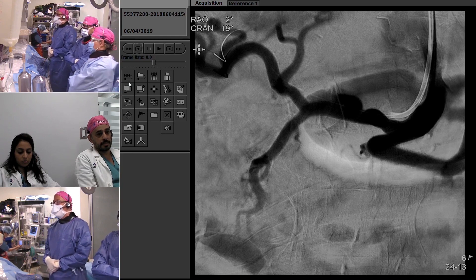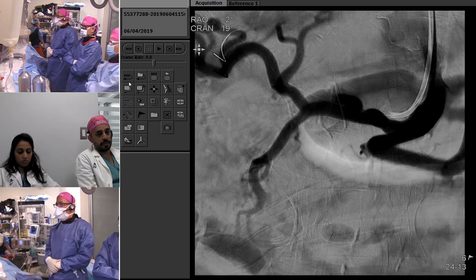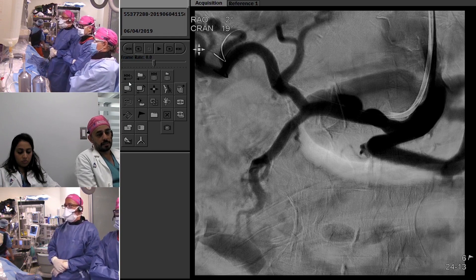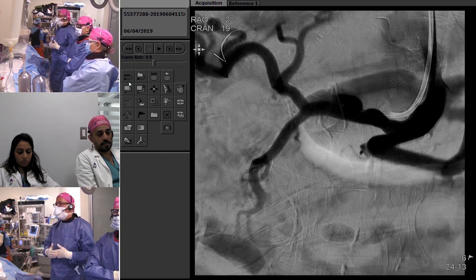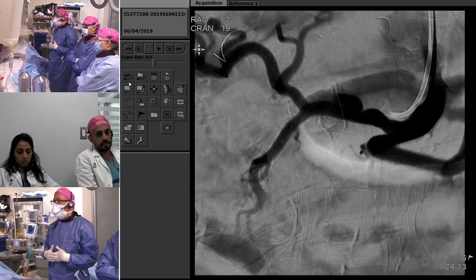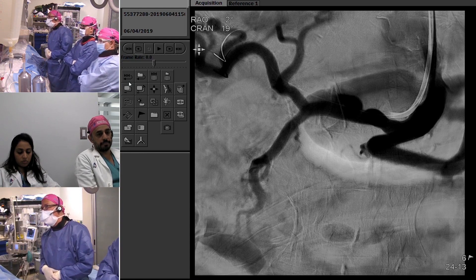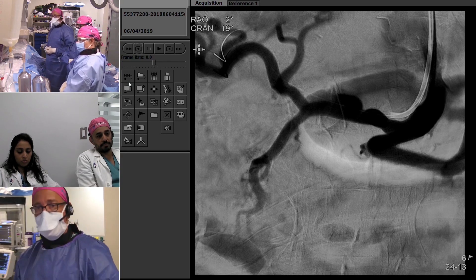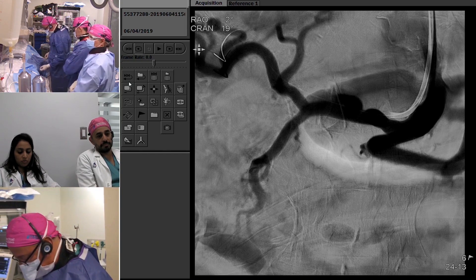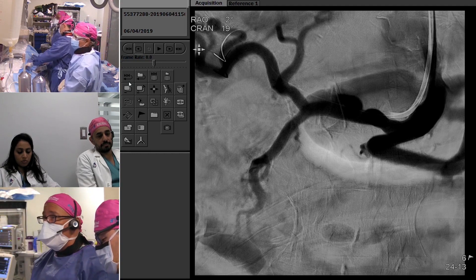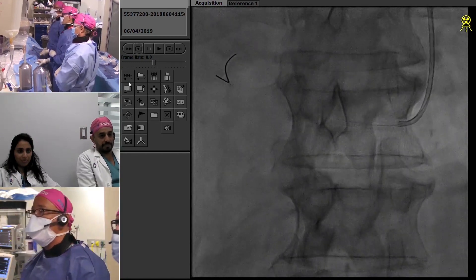We could do a lot of different things here with a six French guide, and I asked for input from the audience. To lay an endograft, we would have to take the GDA, which I didn't think was ideal because if the endograft fails, you'd leave the patient with arterial compromise to the liver. I wanted an option to preserve flow through the GDA for collateral circulation through the pancreaticoduodenal arcades. Sabine from the audience suggested stent-assisted coiling — good minds think alike. So that's exactly what we're doing.